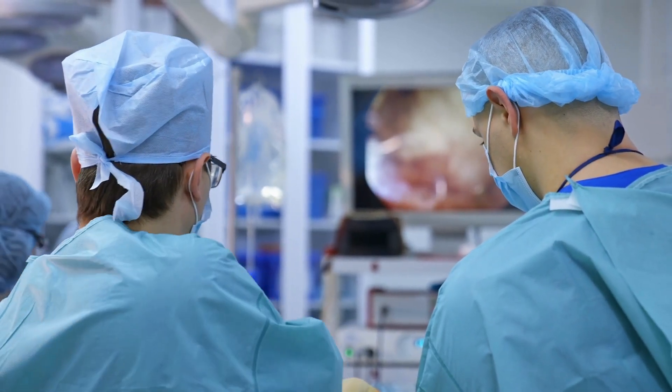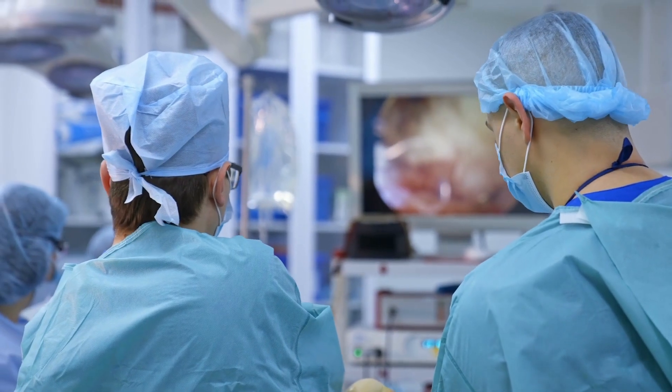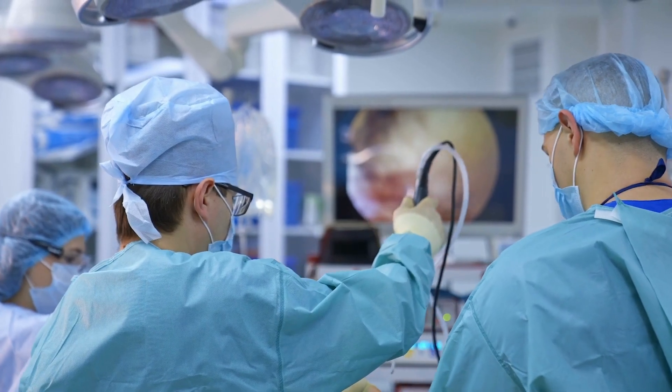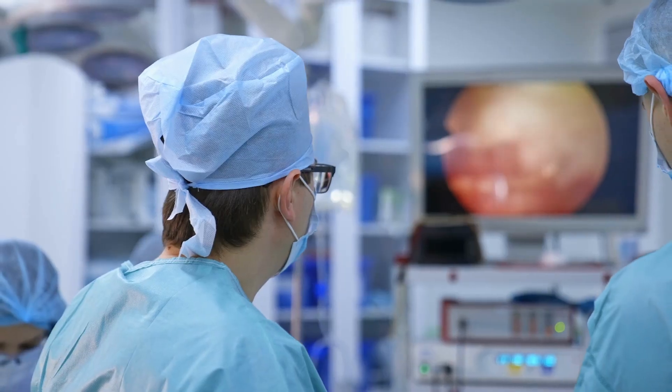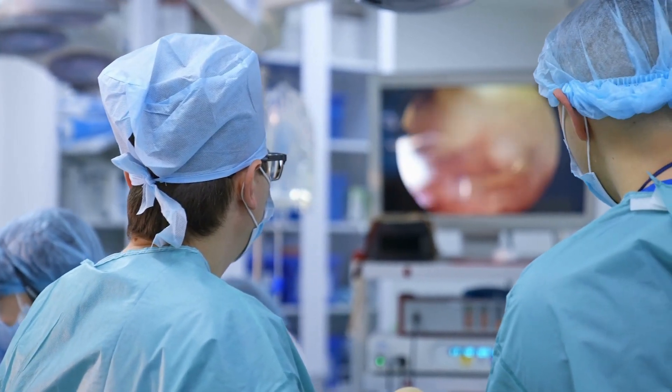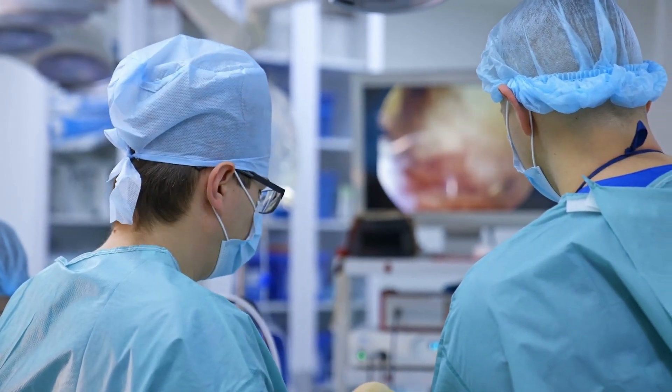The second important fact is that laparoscopic instruments have delicate parts. They have delicate and small parts that can easily be damaged during the cleaning and disinfection process.